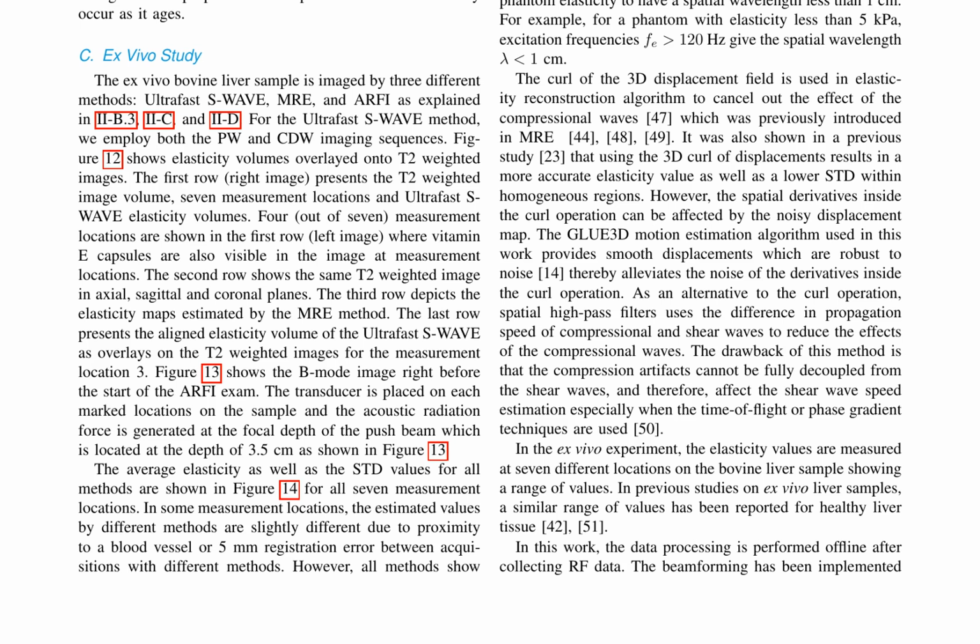The use of the curl operation in the elasticity reconstruction algorithm is also discussed, which aids in cancelling out the effect of compressional waves and results in more accurate elasticity values and lower standard deviations within homogeneous regions.